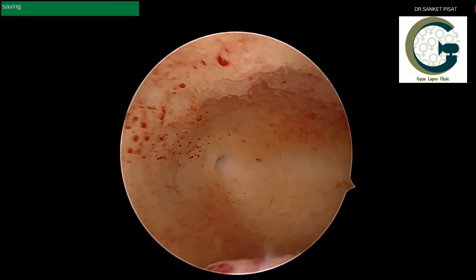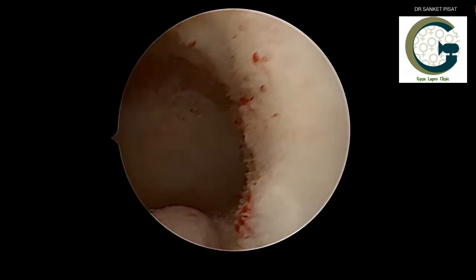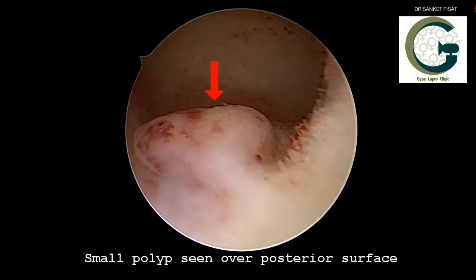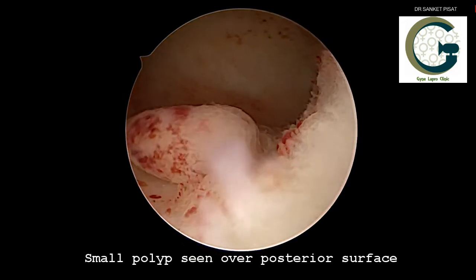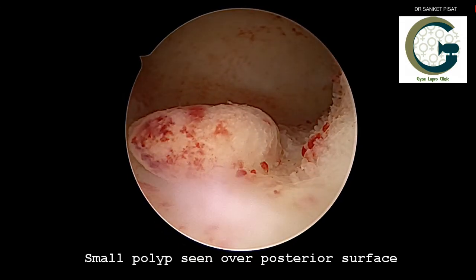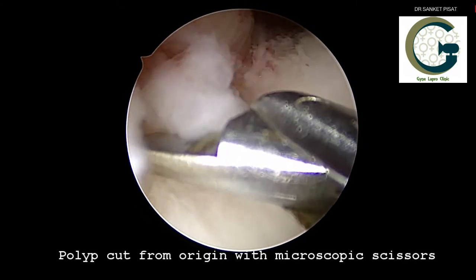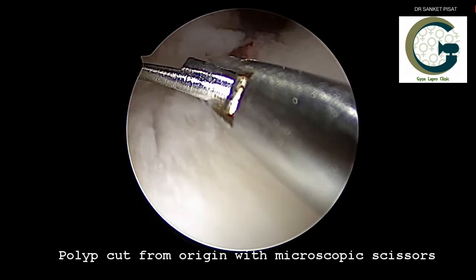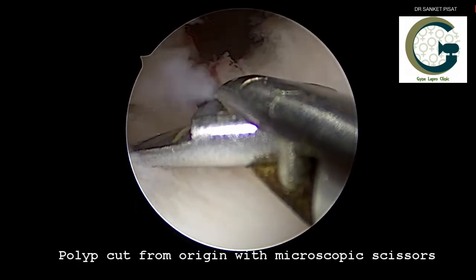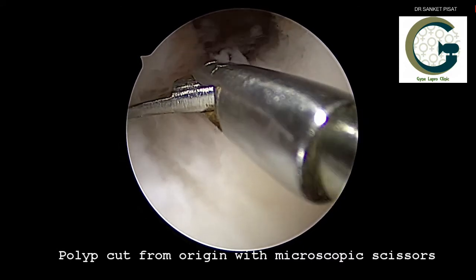In this second patient, we will see that the left and right tubal ostia are seen, but there is a localized endometrial growth which is seen at the 6 o'clock position over the posterior surface of the uterus, which is a small endometrial polyp. This endometrial polyp may or may not be cancerous and can cause heavy menstrual bleeding and irregular periods. So using a surgical micro scissors, the polyp is cut from its origin with the hysteroscopic scissors.